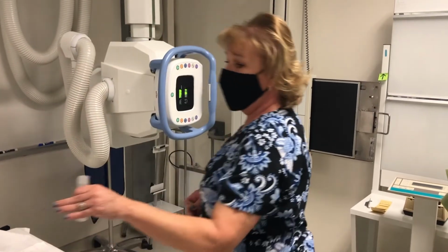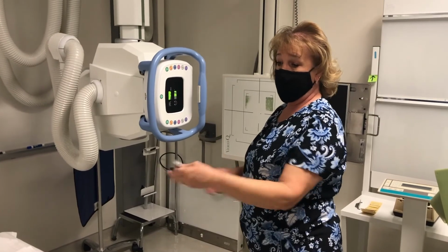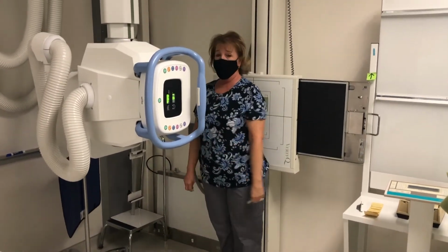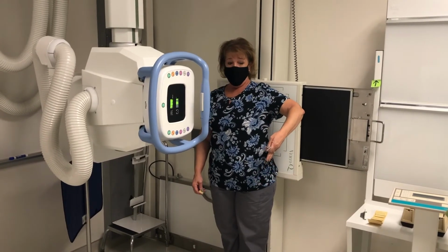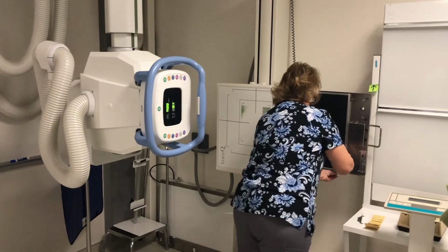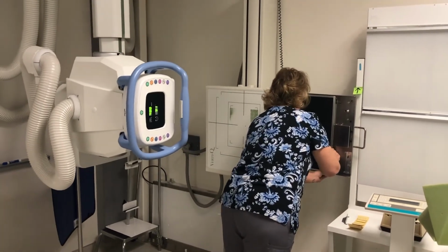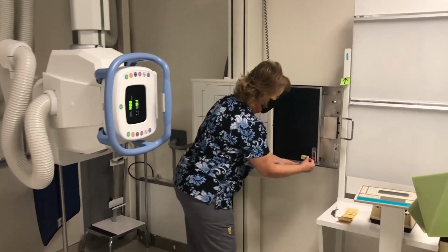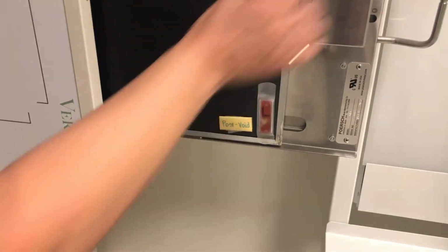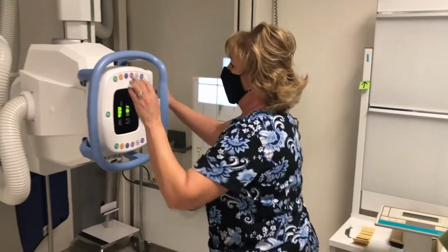So this whole time I've been marking her right side because that's the side closest to me. Now with her in an upright position, you have to remember to switch and use your left marker. So I'm going to put my left marker here. I'm going to put another indication that says post void. And get this centered.